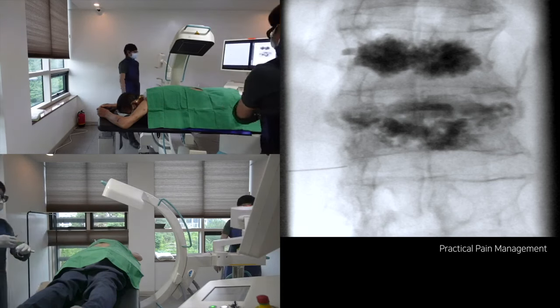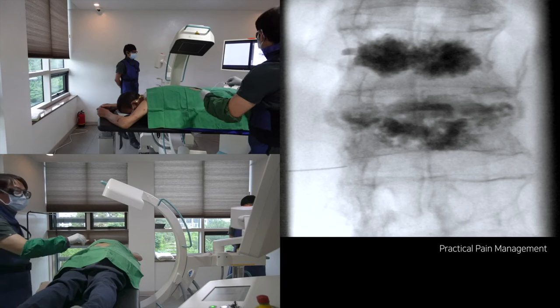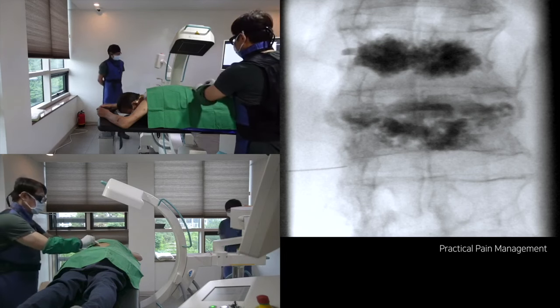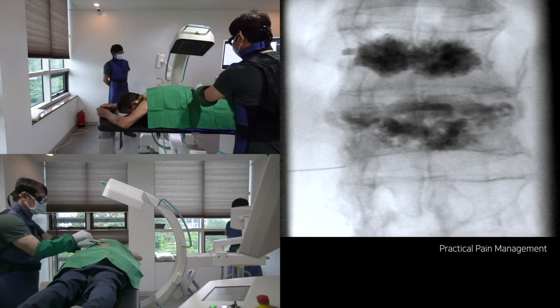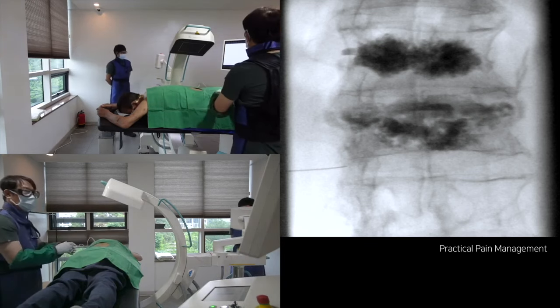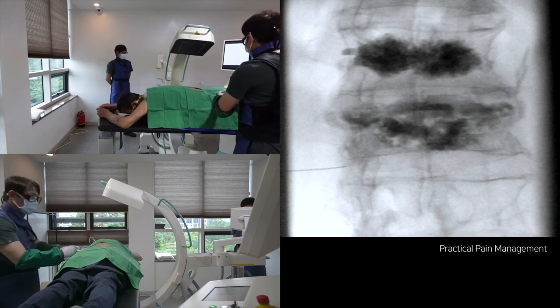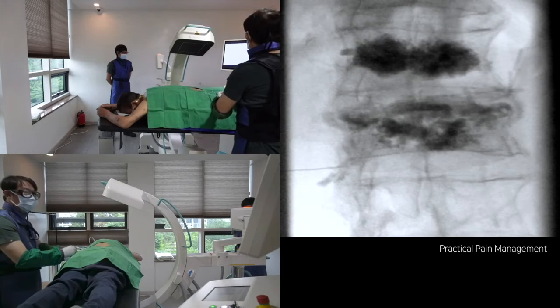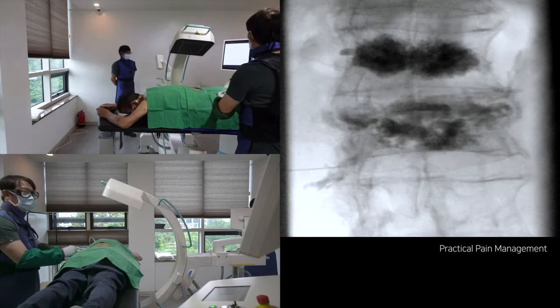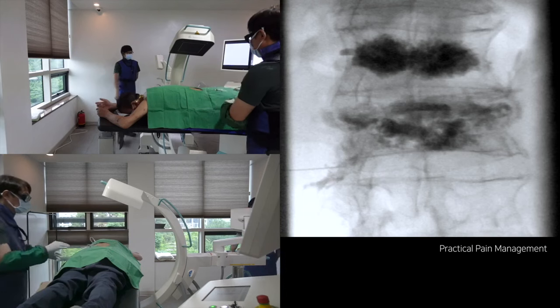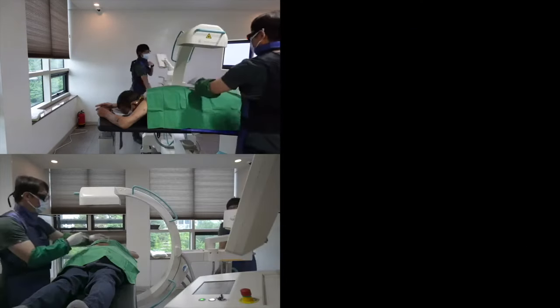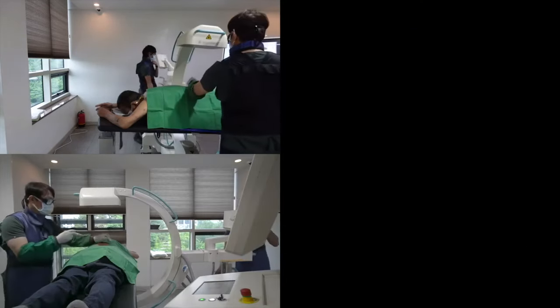Let me connect the mini volume connecting tube to the spinal needle and contrast the media-filled syringe. Administer the contrast dye while observing the contrast spread. Do not press the piston fiercely.